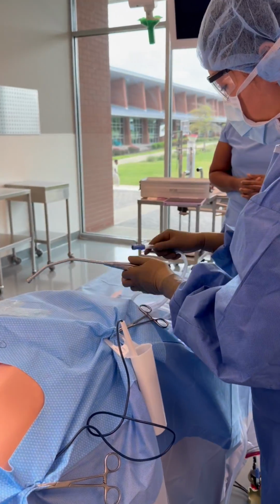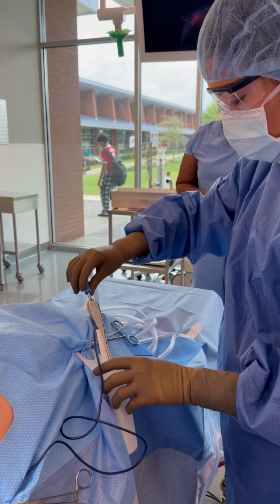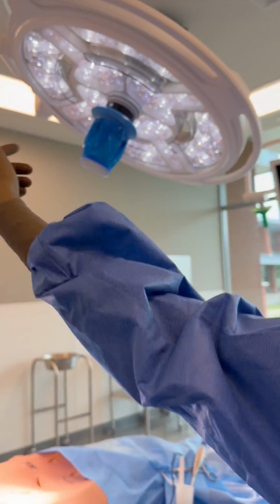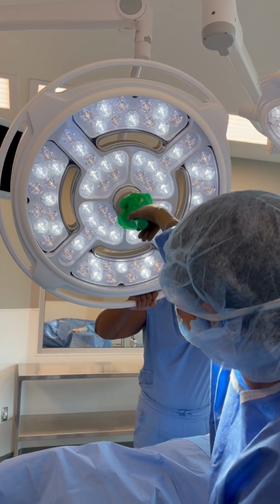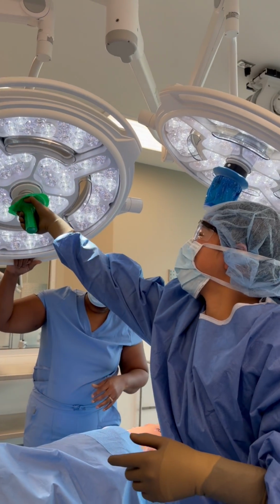I'm going to connect the tip to it here, and then we're going to put it over here for the surgeon. And then we're going to set up our light covers. Circulator, can you please bring the light towards me? And then that's how we set it up.